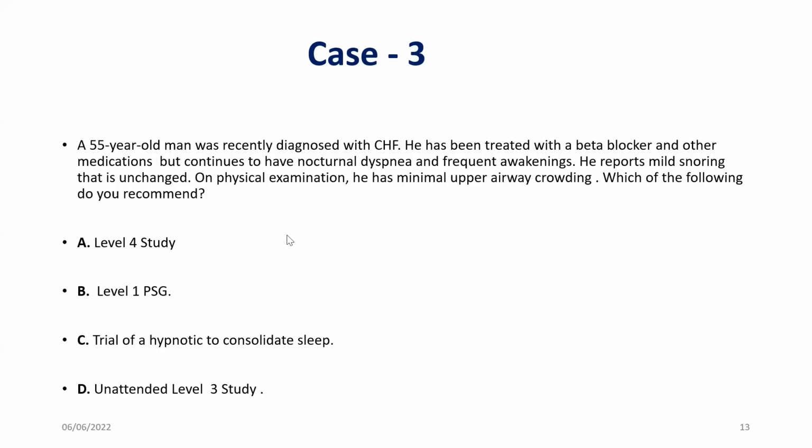Level 1 PSG. Yes, level 1 PSG, because it's a case of CHF, and it will have a lot of central apneas in this case. So we have to have attended level 1 PSG.